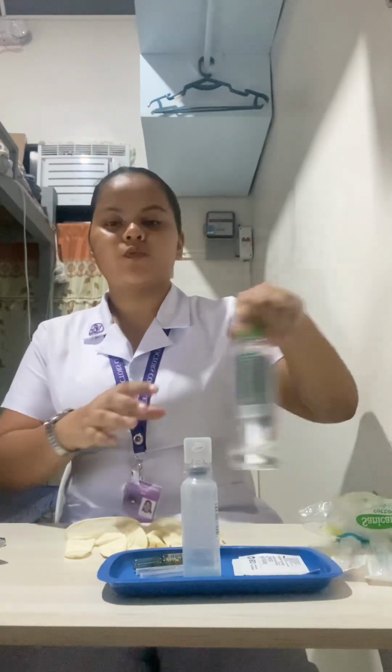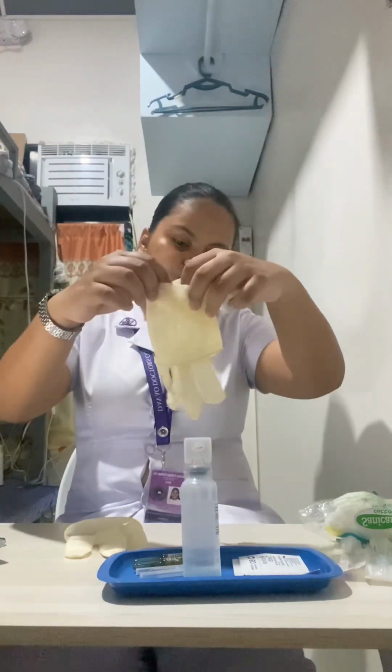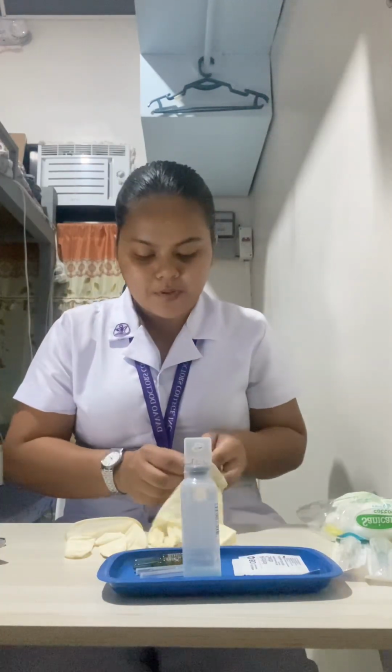So now I am going to prepare medication from a vial. First, I'm going to perform hand hygiene and observe other appropriate infection prevention. This is to prevent any spread of microorganisms or cross-contamination.